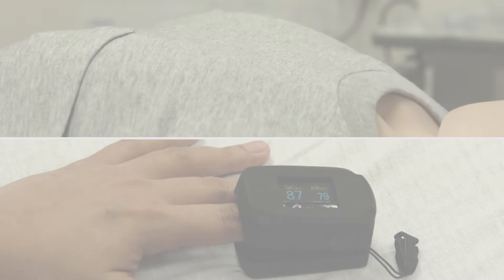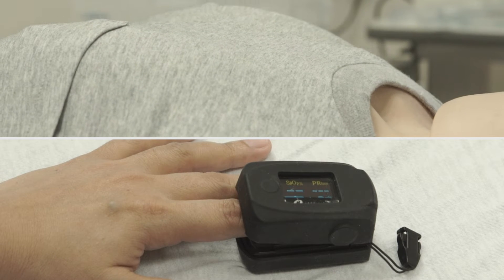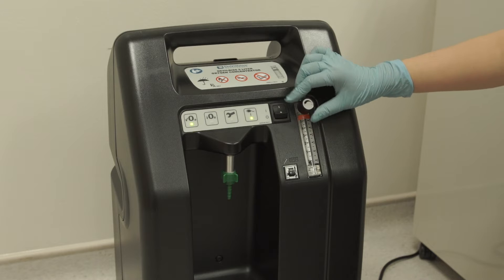Supplemental oxygen can be given when a patient feels breathless or SpO2 is low. Switch on the oxygen concentrator and adjust the flow by turning the knob.